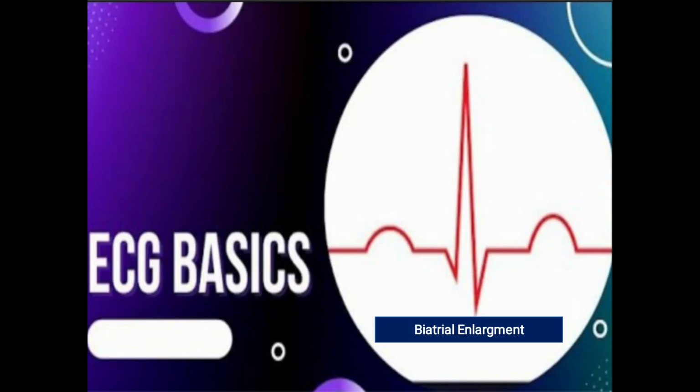Hi friends, in this topic of ECG basics, today I will talk about ECG changes in biatrial enlargement.